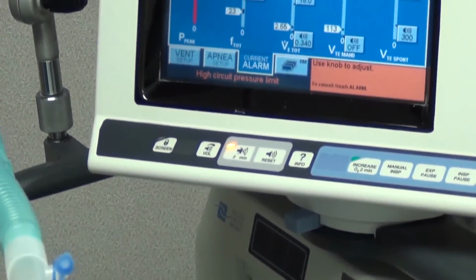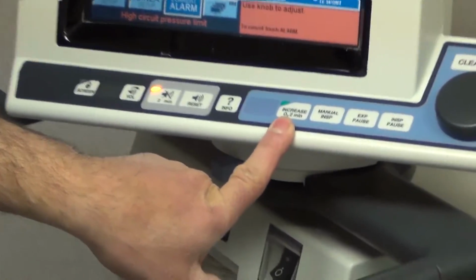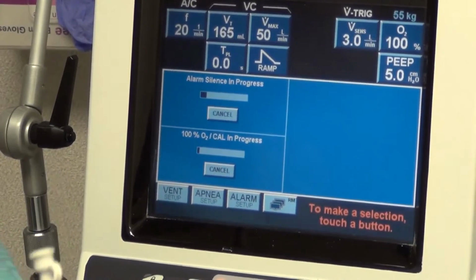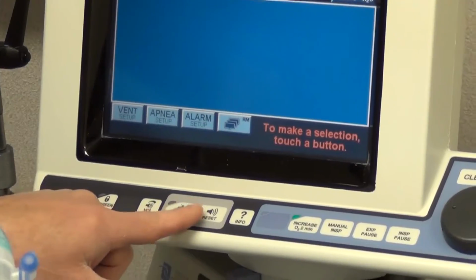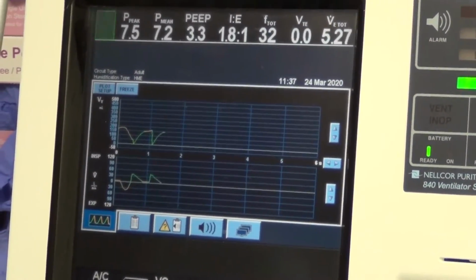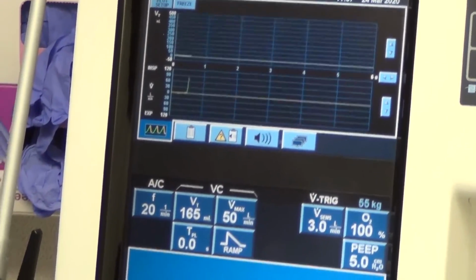If you were going to suction a patient, you want to pre-oxygenate them. And if you look right here, it says increase O2. You would hit that, and it gives 100% oxygen for 2 minutes. And since we've shown that, I'm just going to cancel those things. The alarm resets the alarm. And notice we're still having peak pressure. That's because this test lung is very hard to ventilate, especially with that much volume. It's very little test lung here.